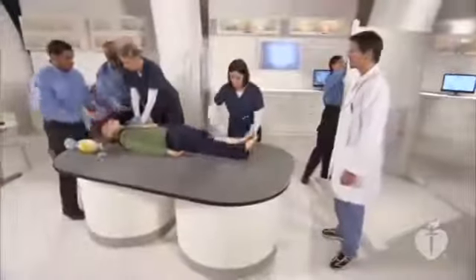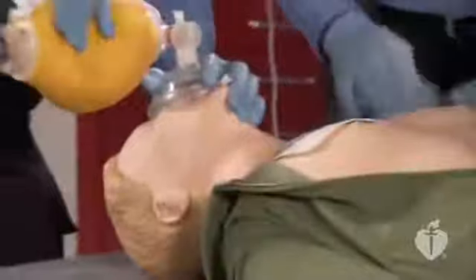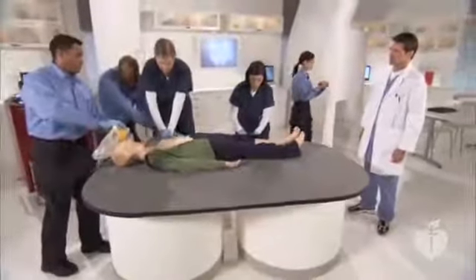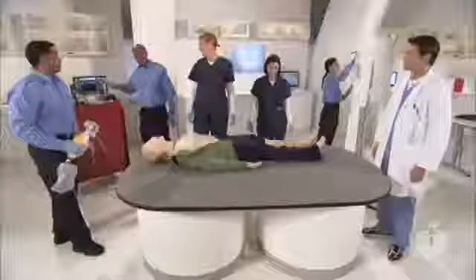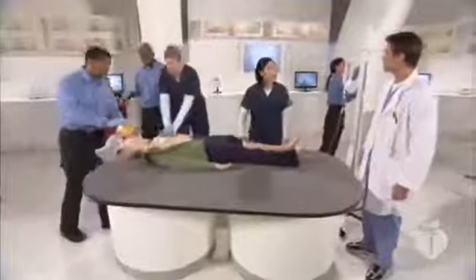Moving to IO access. Charging at 200 joules. Shock ready, clear the patient. Shocking on 3. 1, 2, 3, shocking. Shock delivered. I have IO access now.